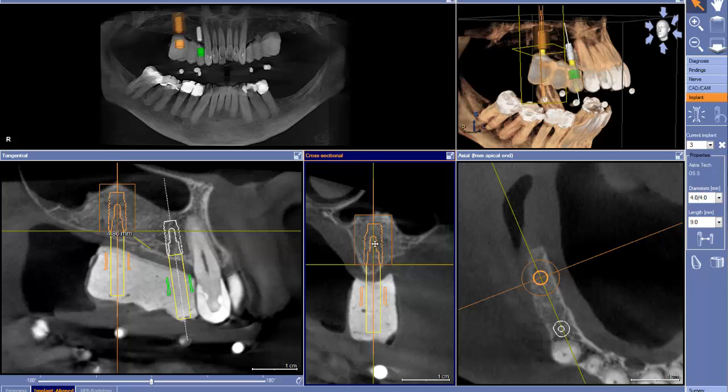It looks like we've got a wonderful bone density and fill. We've got a good Schneiderian membrane here intact. This is a very well done graft. And now the patient is ready for restoration. So let's go through it.